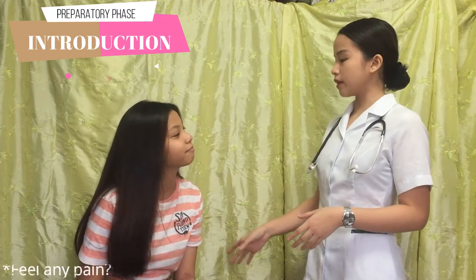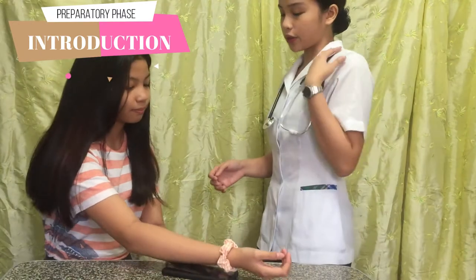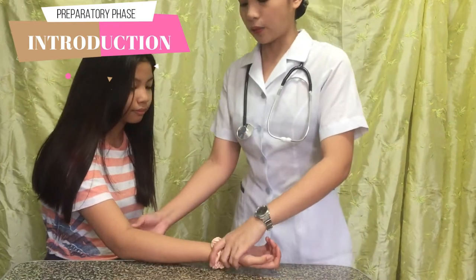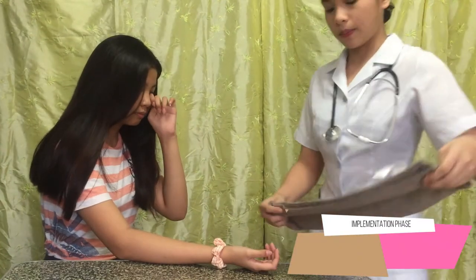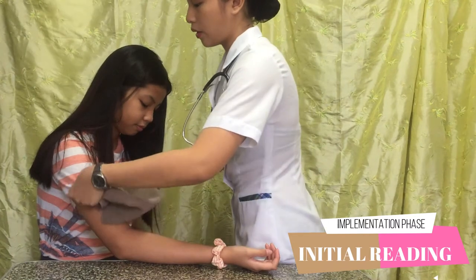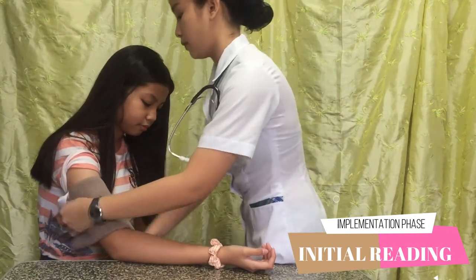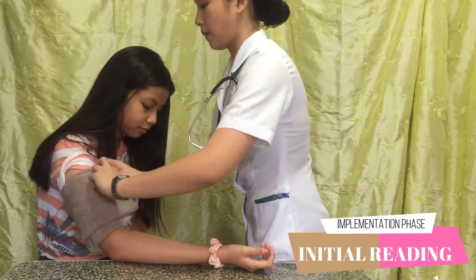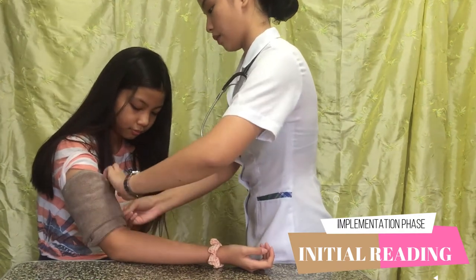Do you have any pain? No. So Lindsay, I want you to sit properly please. We are going to have the elbow flexed with the palm up. So I don't have a BP apparatus, so we are going to assume that this is the cuff. We are going to roll the sleeves first. And I am going to place my non-dominant fingers here.